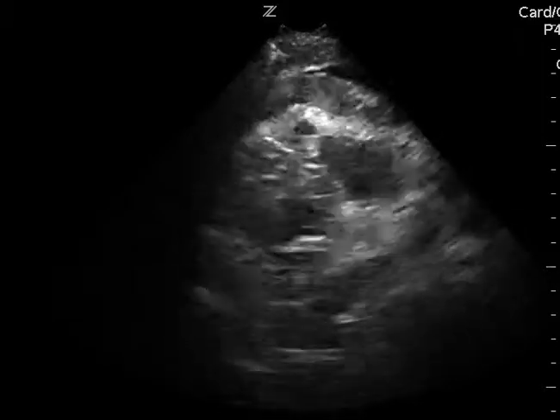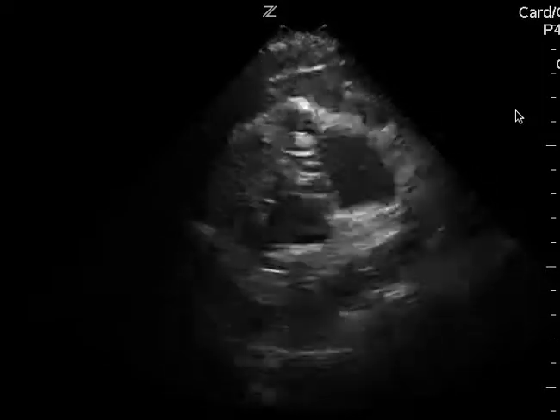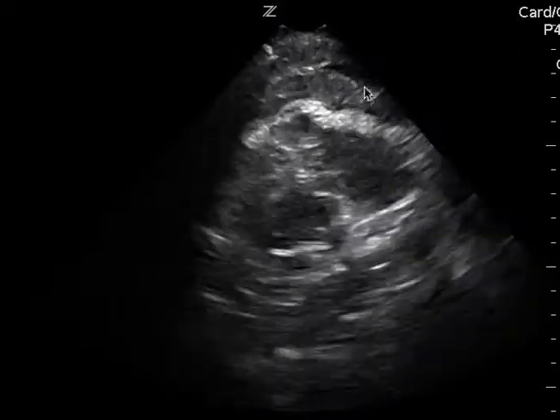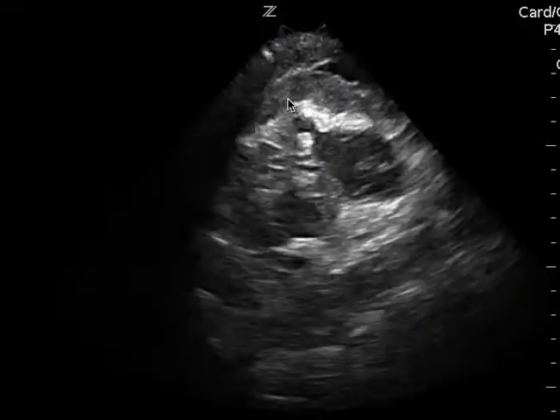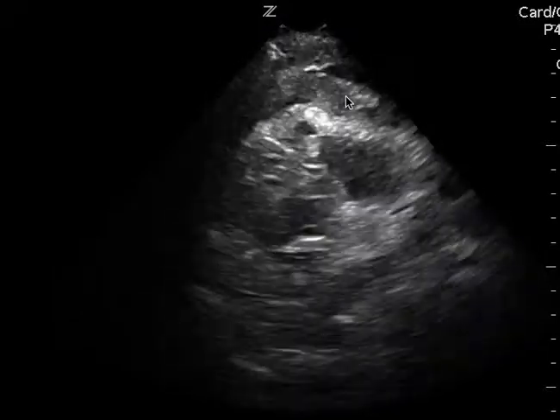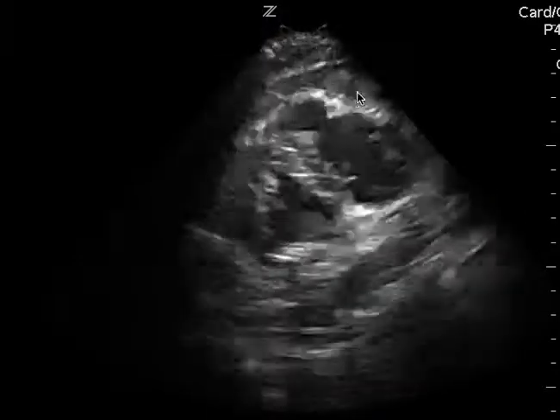this is your cardiac ultrasound. It's oblique. I have the left ventricle and right ventricle in view, but what's concerning me is this right here, and this looks like a pericardial effusion. This here is either a very large fat pad, or sometimes this is what clot can look like, but this is concerning for a pericardial effusion.